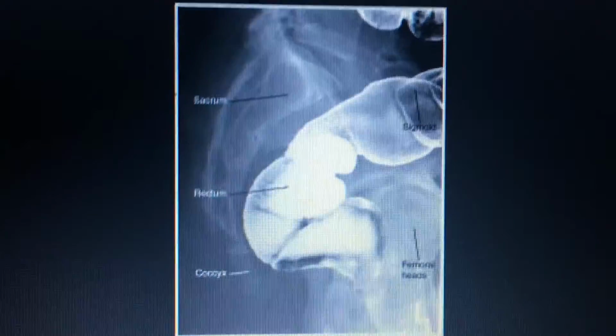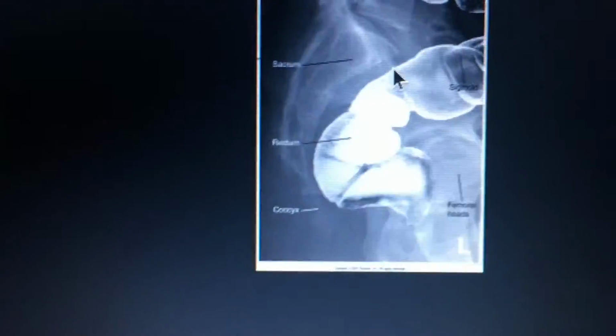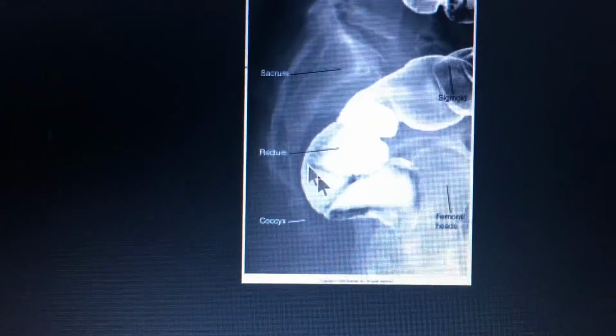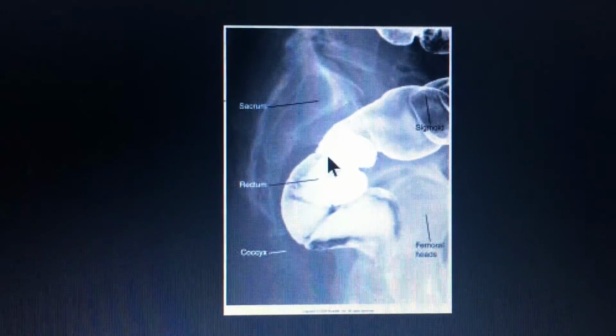This here would be the left lateral sigmoid or rectum. You can see here the sacrum, coccyx. This would be the sigmoid, and to the rectum. You can see the double contrast.